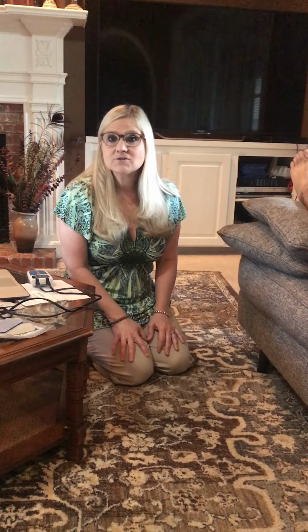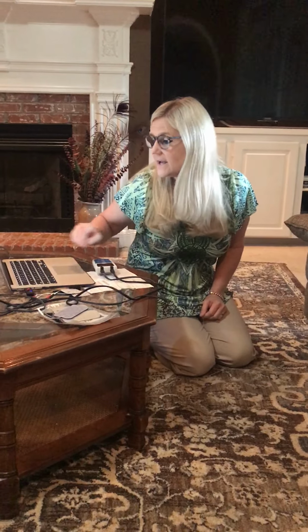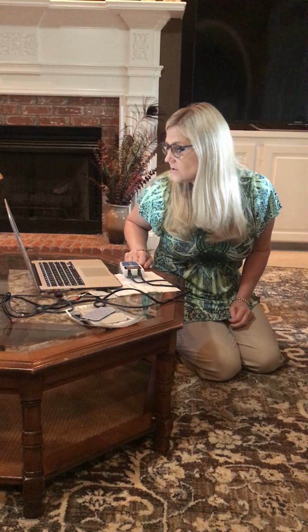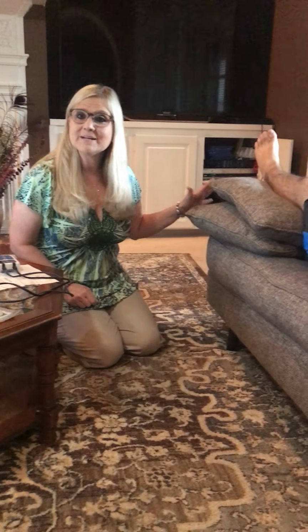Today I'm going to talk about interferential current, and I'm actually going to do a treatment of a patient with IFC. On number 4 on your scenarios, the patient is a 17-year-old male with a healed inversion sprain of the left ankle. Injury occurred 6 weeks ago. He has chronic edema, decreased range of motion, and some pain issues that are limiting his function.